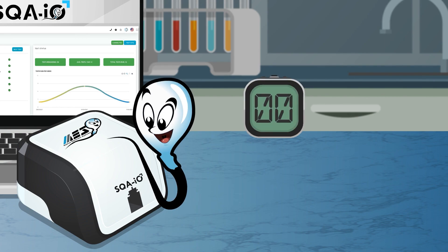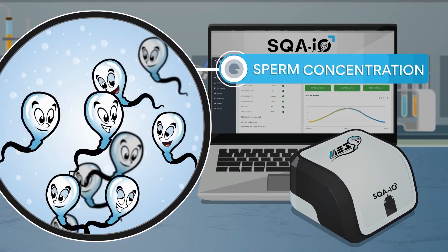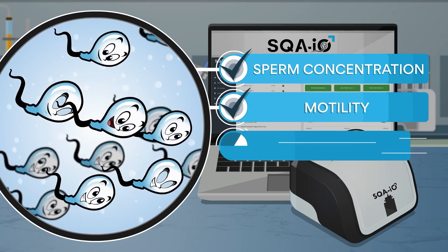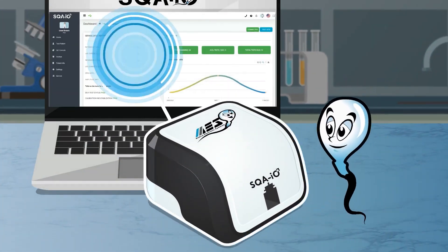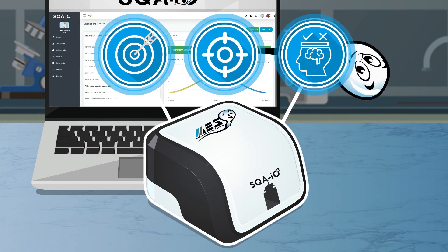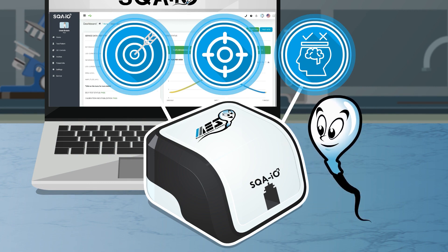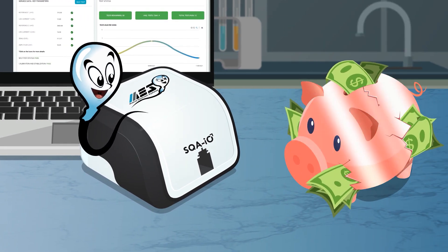The SQAIO runs a 75-second semen analysis and reports sperm concentration, motility, progressive motility, normal morphology, and more, with far greater accuracy, precision, and objectivity compared to manual methods and other automated alternatives. The SQAIO is a powerful tool that won't break your budget.